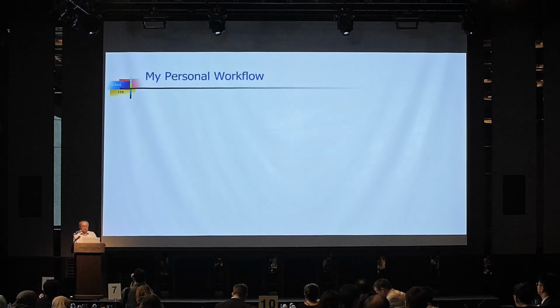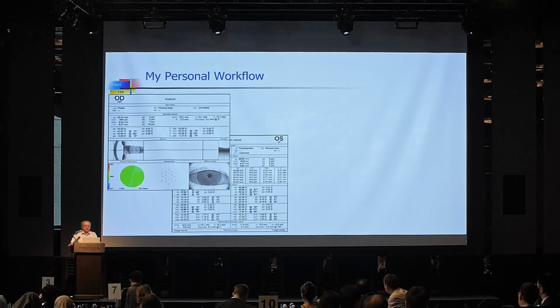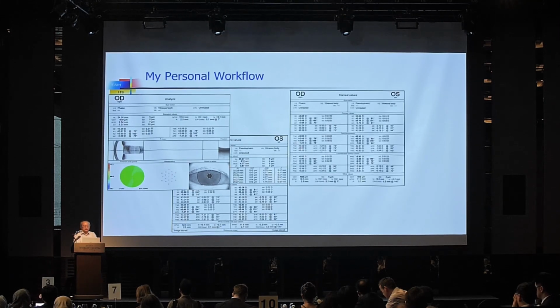Okay, so this is my personal workflow. I almost always have the analysis printout. This is the analysis page. Of course, we have also this printout. Why this printout? I will tell you later. And then the posterior K printout.